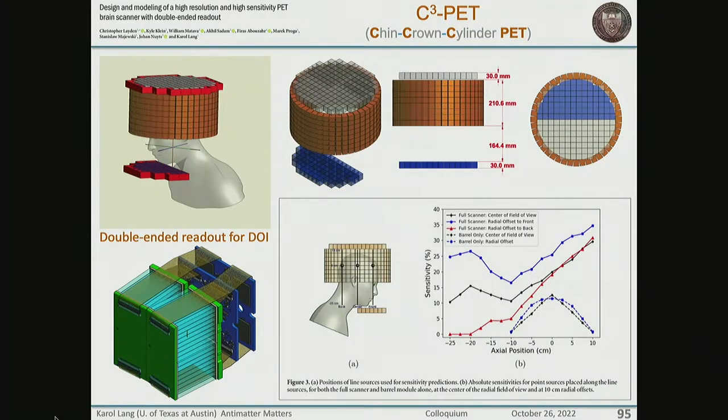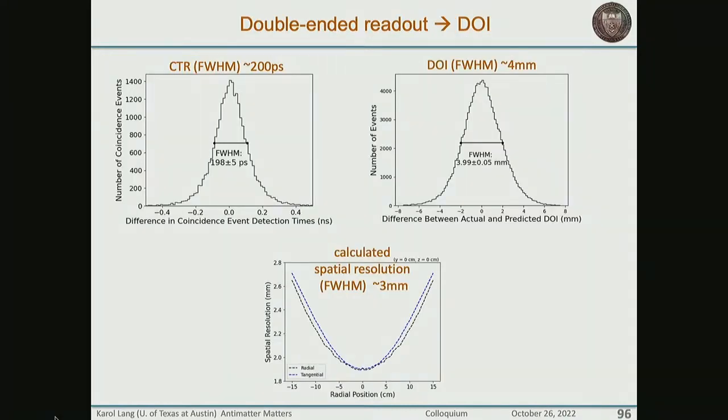The thing I want to emphasize is that this number here is 25%. And the cylinder itself is roughly half of this along the center line of where the possible tissues can be. So the addition of these panels makes the whole thing a lot more hermetic, and thus improves the efficiency.